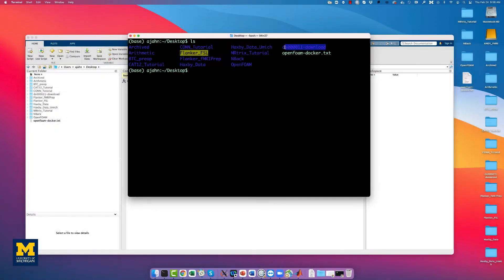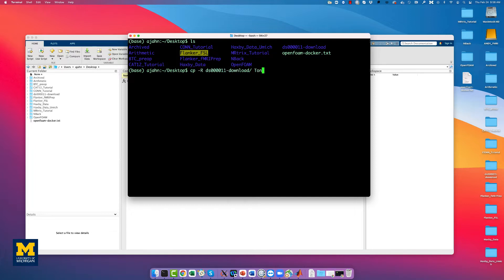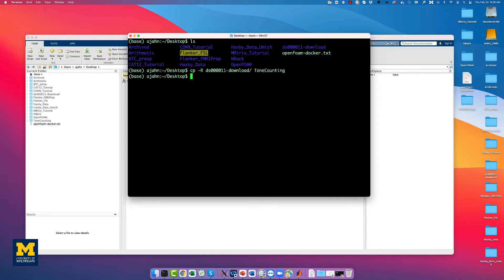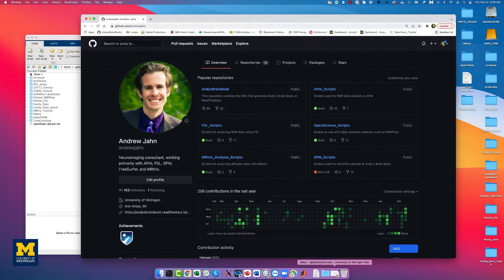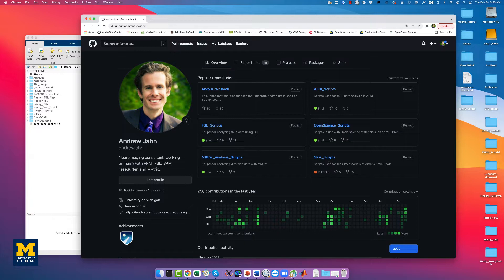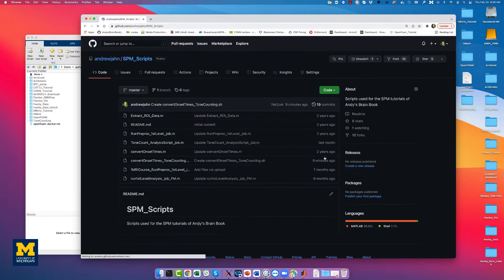What we're first going to do is copy this downloaded dataset that we downloaded in the previous tutorial into a directory called tone counting. Once that finishes copying, the first thing we're going to do is look at the timings for each subject and convert them using these scripts on the GitHub.